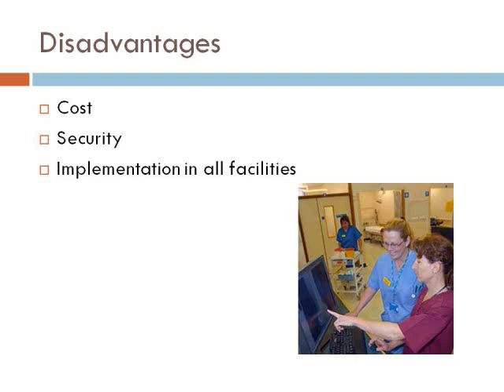Another disadvantage is that not all the facilities in hospitals and physicians' offices have a PACS system in place at their respective areas. Therefore, while it's good, it's not useful if only the hospital has it, but the physician's office does not have the system to be able to view the images that are uploaded digitally.